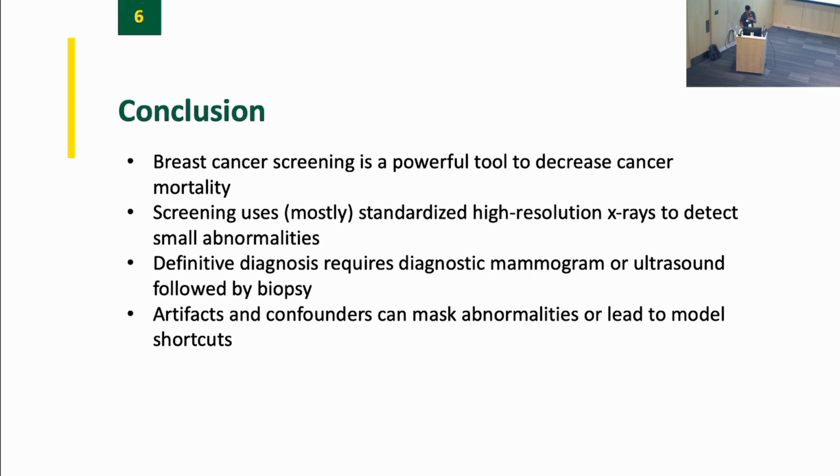Mammography is a powerful tool for cancer detection. Very high resolution x-rays, very low signal to noise ratio, and you should be very aware of confounders, which we'll talk about over the next coming days. So, questions?